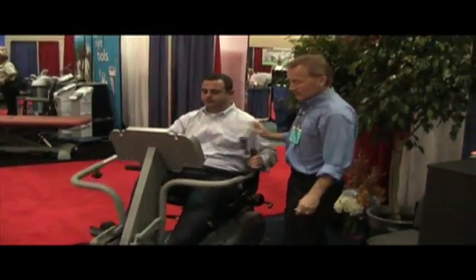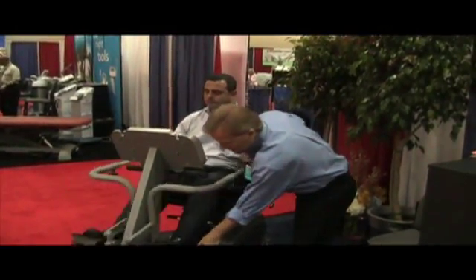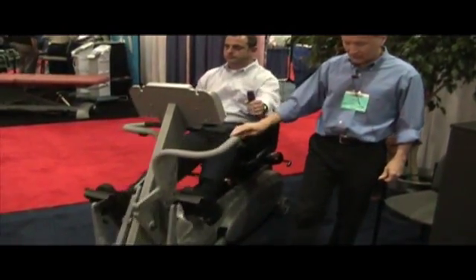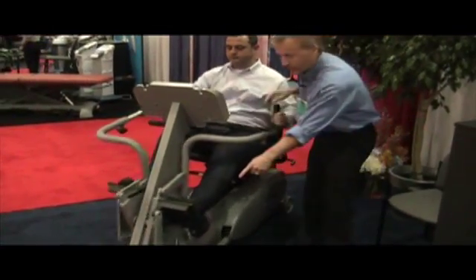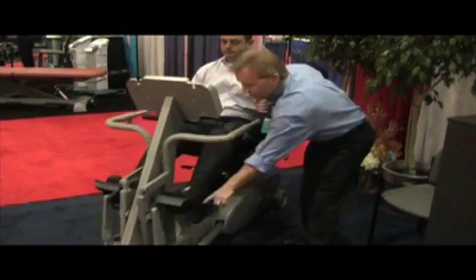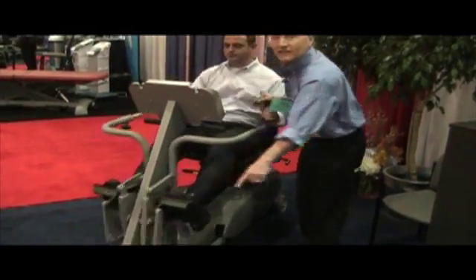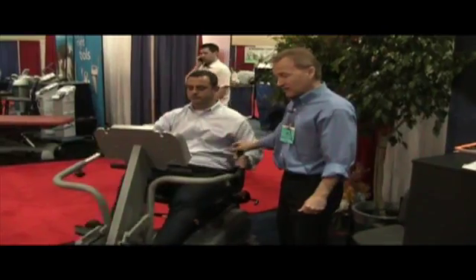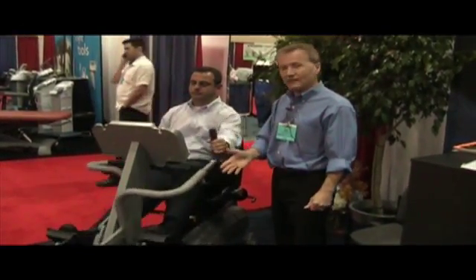As the patient is pedaling, we're articulating the foot plate so you can see just like when somebody's walking — they're doing a leg extension, they do a dorsiflexion and you stretch the Achilles. That's exactly what's going on here on the patient's foot. We drop the heel, dorsiflex the foot at extension, and it's not a stepper — it's a semi-recumbent elliptical so there's no starting or stopping motion. It's very smooth and gentle on the joints.